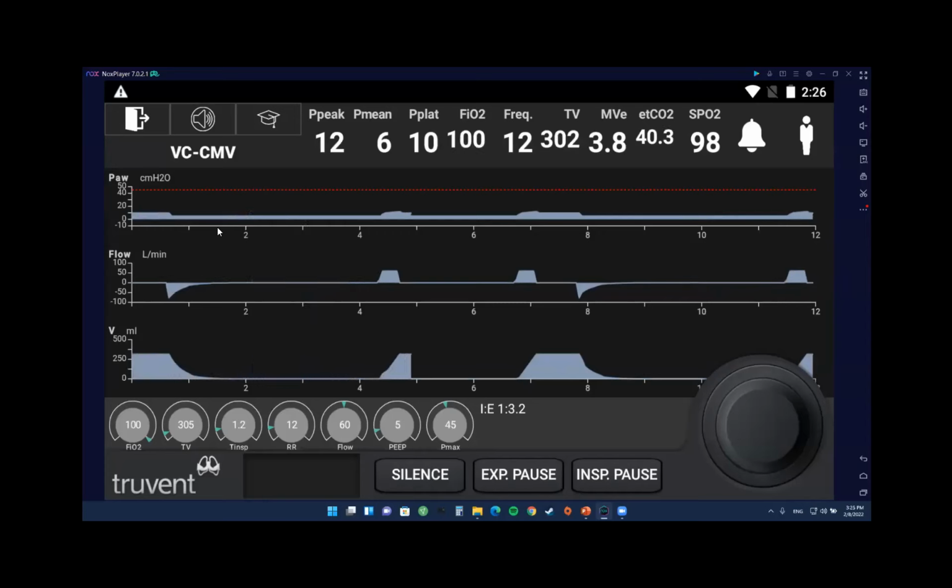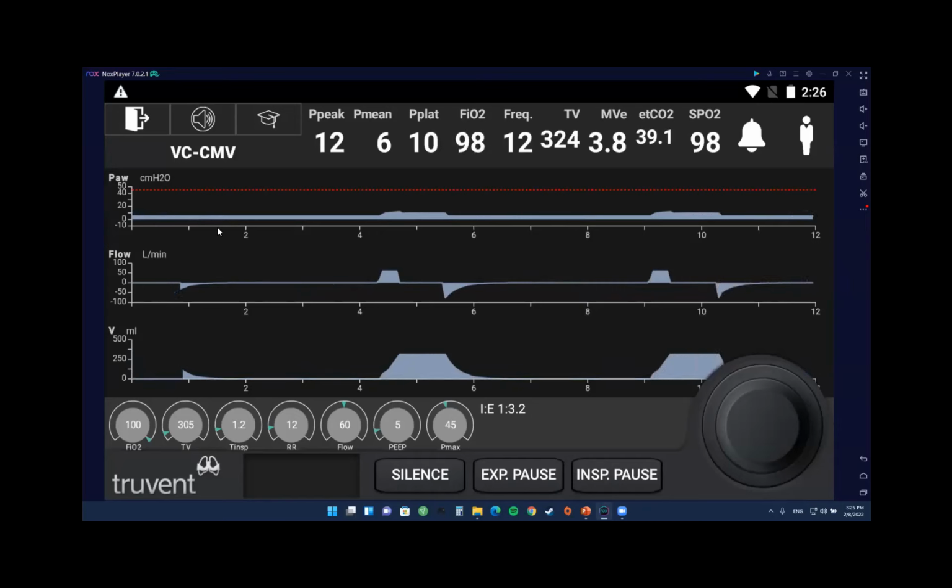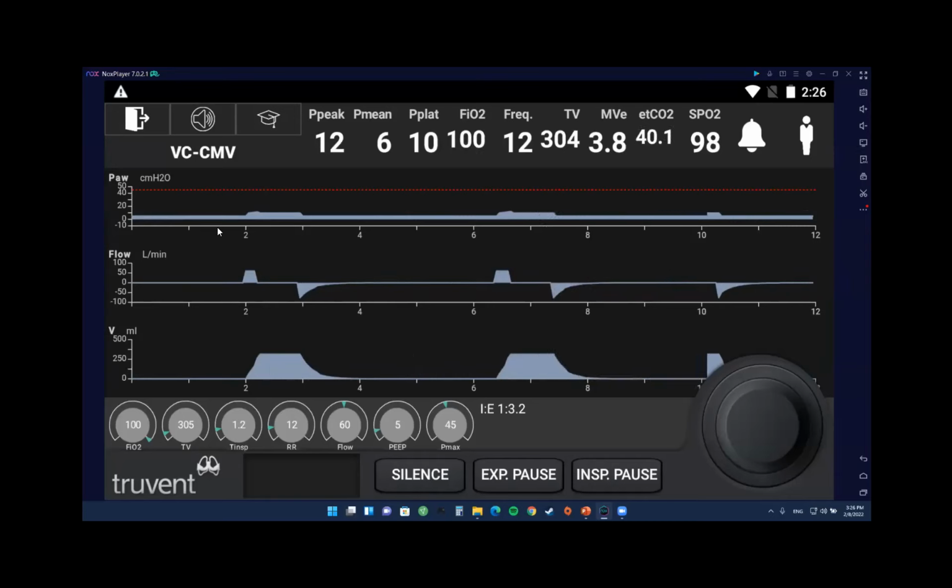Awesome. Okay, guys. So this is literally what you're seeing on the ventilator when the patient gets to the unit. And these are the settings that the patient has. Try to think of what the patient had. The patient pretty much had a severe metabolic acidosis with a PCO2 of 40 and a very low pH. So given that these are the settings of the ventilator, take your time, think about it, and what changes do you want to make?